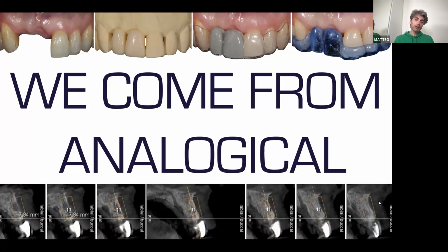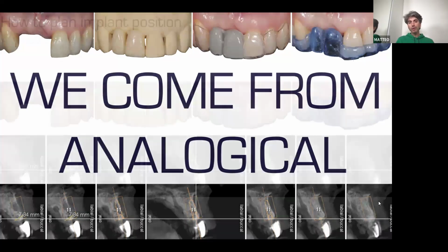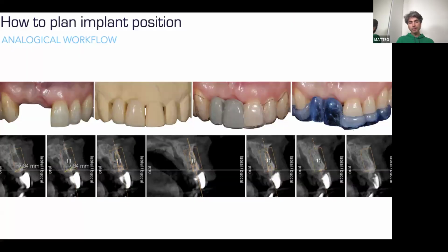So with the radiological guide, we had the possibility to put in relation the bone and the prosthetic tooth. And so we're going to plan the position of the implant according to the restoration and according to the bone. And then we go to surgery.